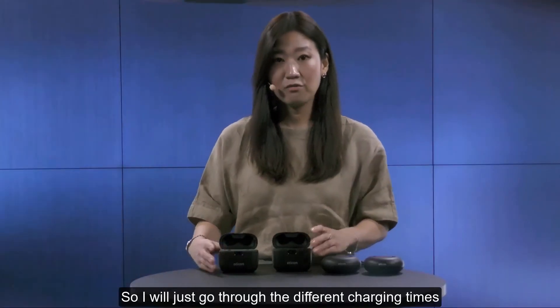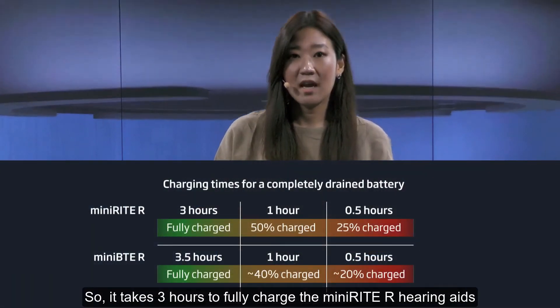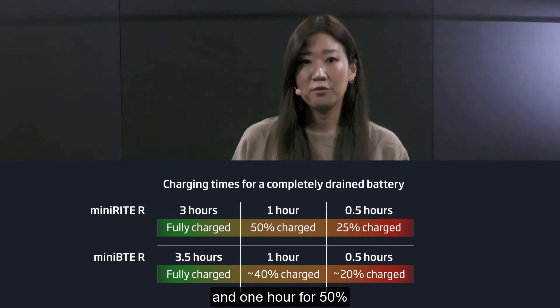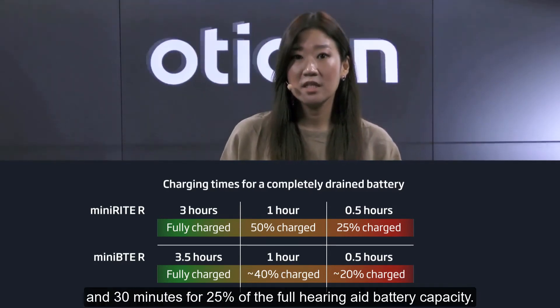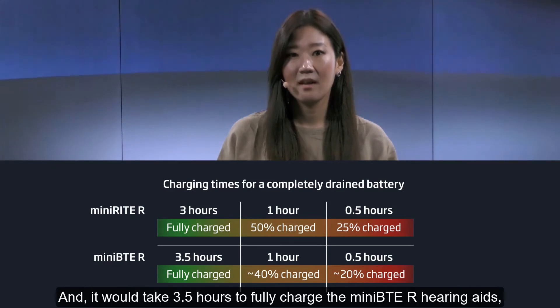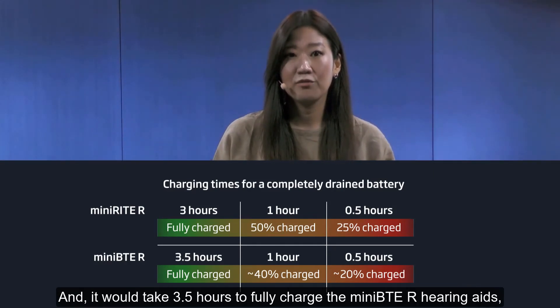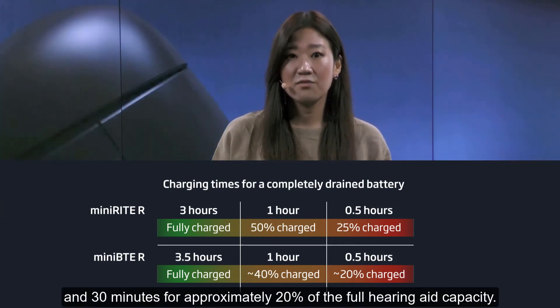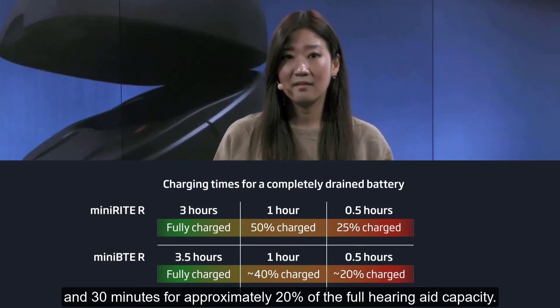The charging times differ between the two. It takes three hours to fully charge the Minirite R hearing aids, one hour for 50%, and 30 minutes for 25% of the full hearing aid battery capacity. It takes three and a half hours to fully charge the Mini-BTE R hearing aids, an hour for approximately 40%, and 30 minutes for approximately 20% of the full hearing aid capacity.